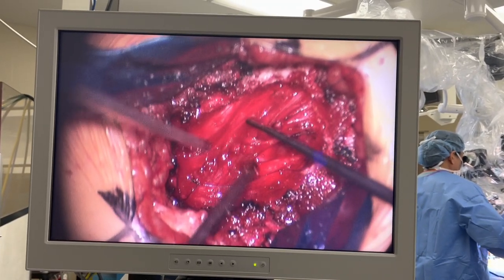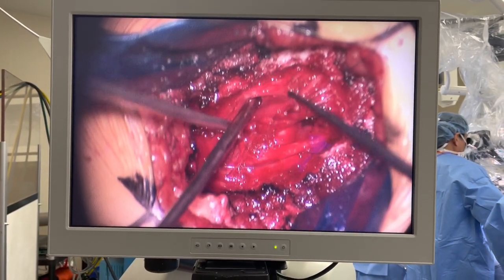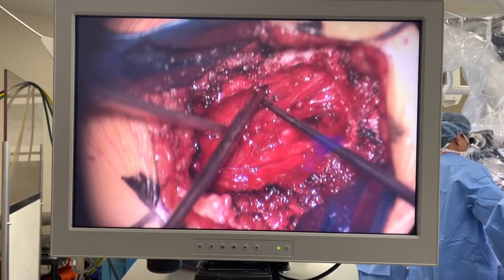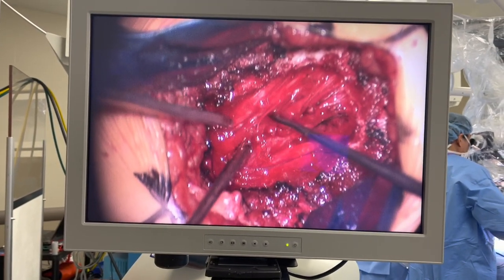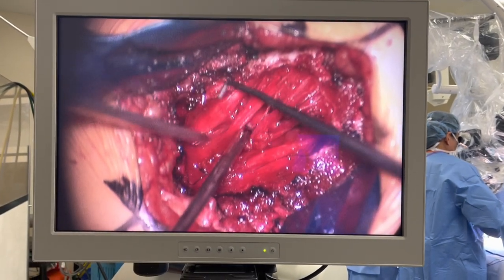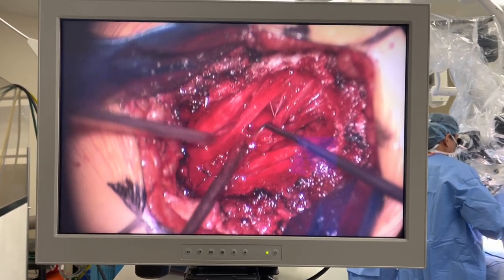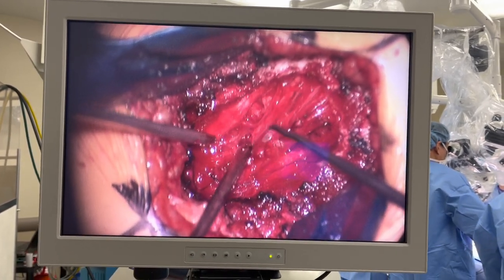You better get better because I am feeling so good about this surgery. Look at that. It's like a revision operation practically. There's so much adhesions. Of course, I get the bleeder right when I'm about to get done. Because you know, my mama always said, spine surgery would be a lot easier without blood vessels and nerves.